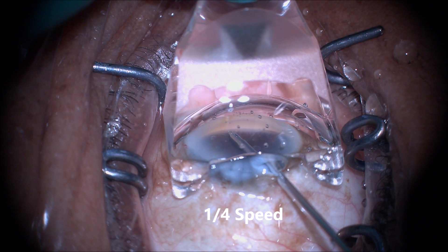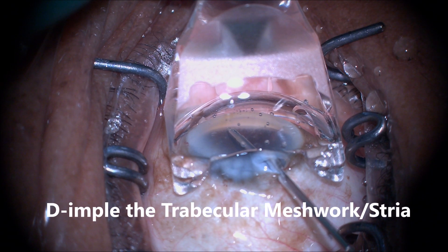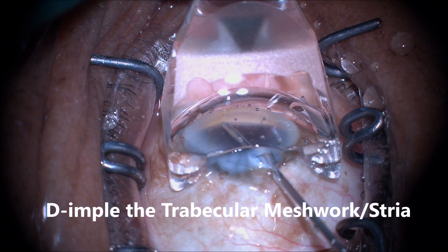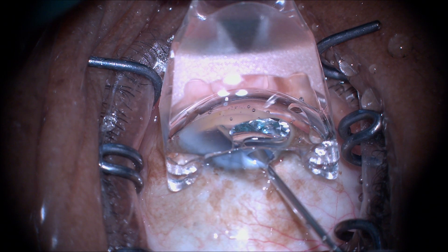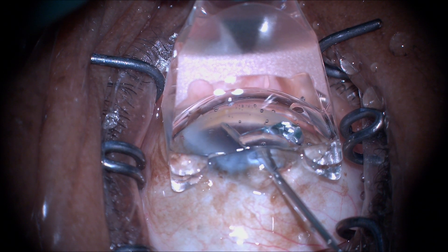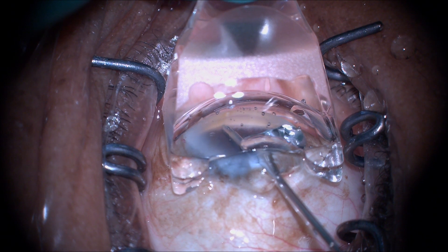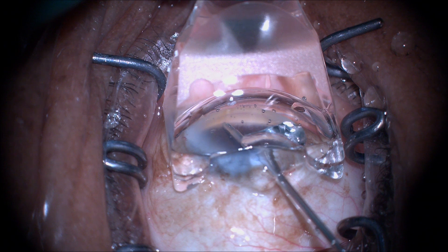I've slowed this down to one-quarter speed so we can navigate the steps of the procedure. First, dimple the trabecular meshwork. You want to counterintuitively press very firmly into the TM, unlike other MIGS procedures, to anchor the IDOS-TR into the scleral wall through the trabecular meshwork. At this point, you do not mind seeing stria on the cornea, unlike other MIGS procedures.